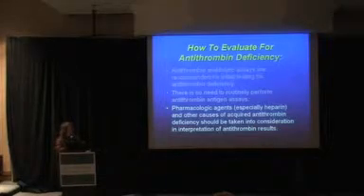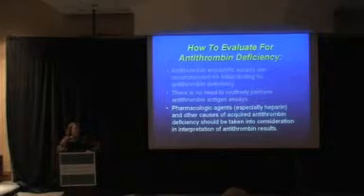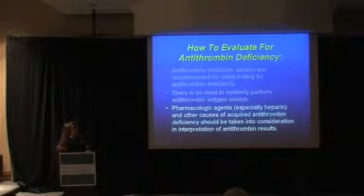you're probably talking DIC or liver disease, not a congenital deficiency. And I get very frustrated at the panels that we get coming from the medical intensive care unit for thrombophilia workups. Because by virtue of being in the medical intensive care unit, over 50% of the patients probably have a consumptive coagulopathy. Most of them have liver disease. And you just get these massive abnormalities of thrombophilia testing. So trying to fend these panels off takes a fair amount of time.